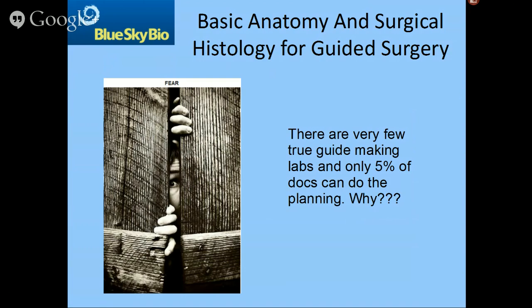I think we've discovered that if we offer the surgery software for free, we take away a lot of the barriers. But then again, most labs are averse at this point in time to making guides.